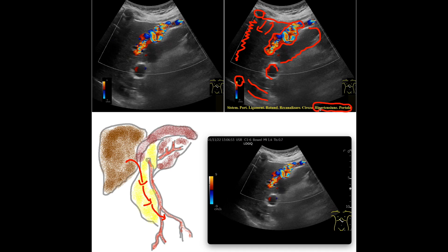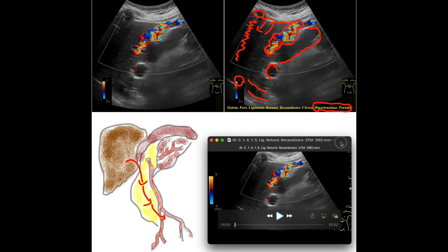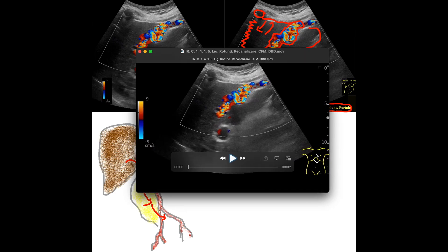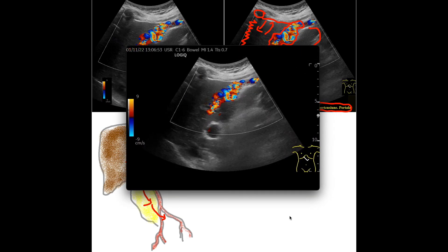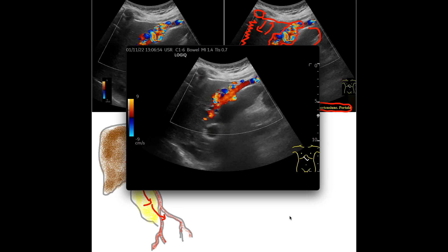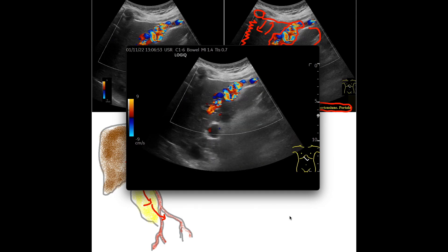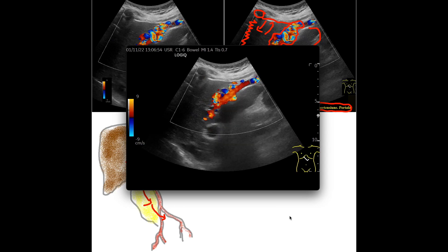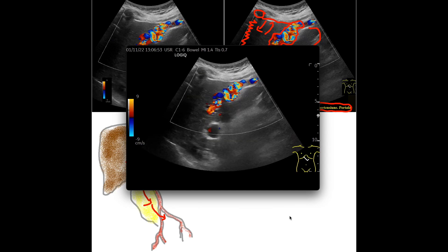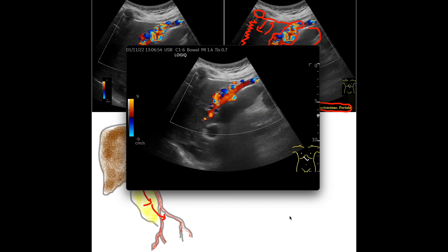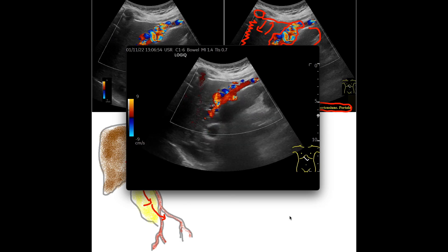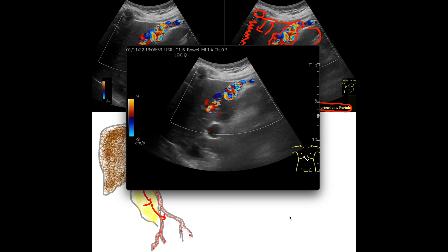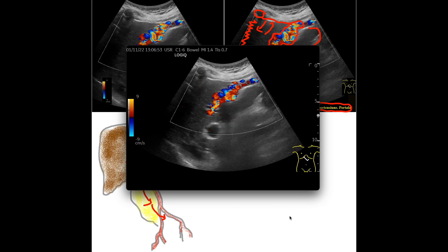The dynamic image highlights the hepatofugal flow — blood coming out of the liver. The red color dominates, with intermittent blue color, representing a spiral, bidirectional flow that is not found under normal conditions. We are dealing with portal hypertension with a natural shunt which, in principle, will for a period of time reduce the pressure regime in the esophageal veins and avoid to a certain extent the risks of upper gastrointestinal hemorrhage through variceal rupture.